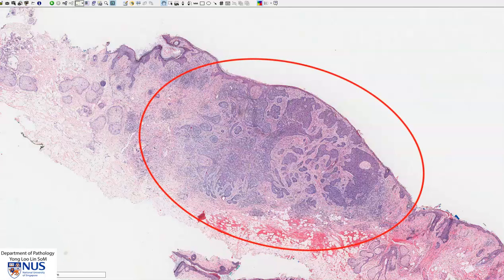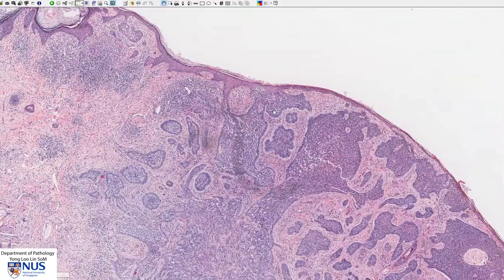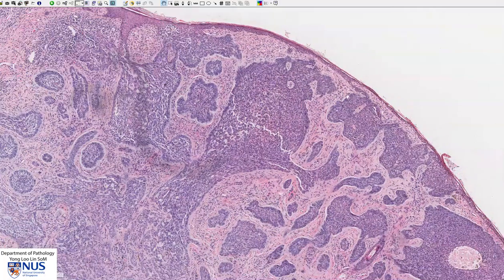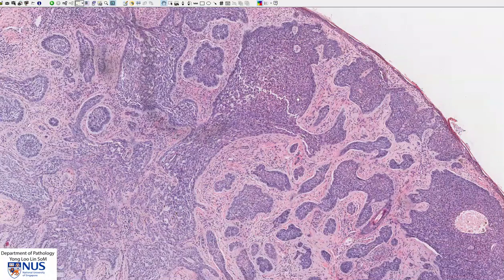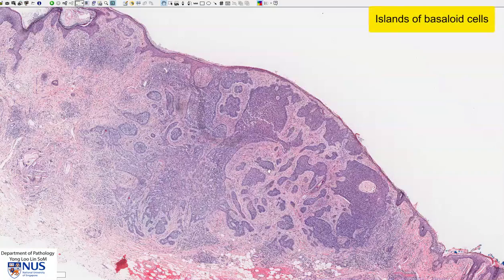This is the region of the tumour and we can see that this tumour is actually connected to the epidermis in this region and also over here. The tumour is composed of these islands, some of which are quite irregular, of basaloid cells.